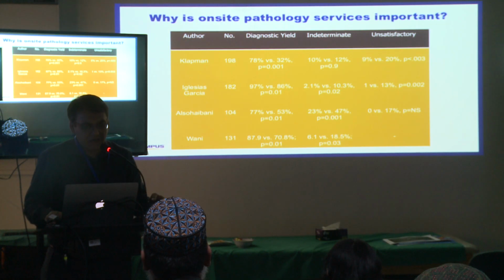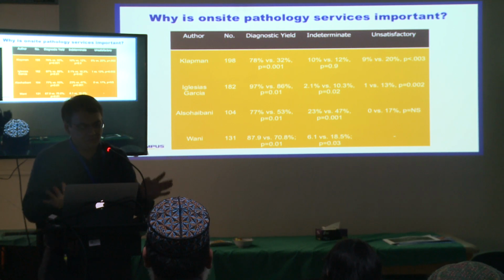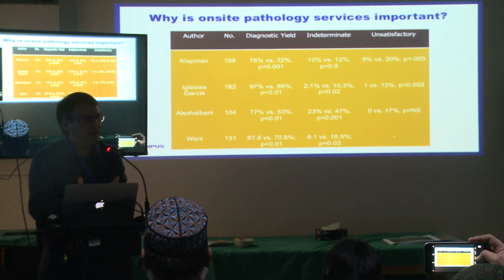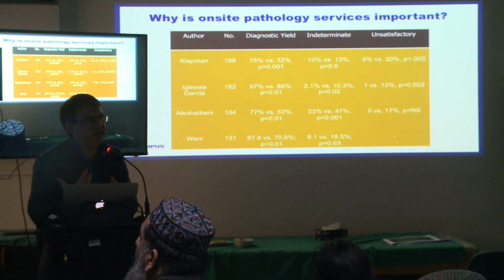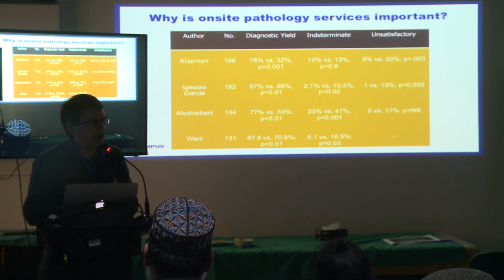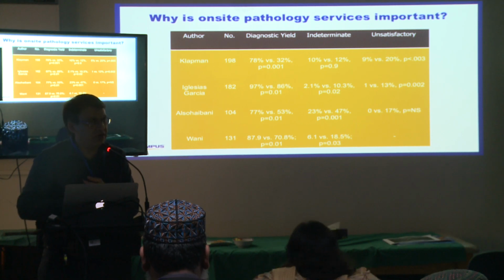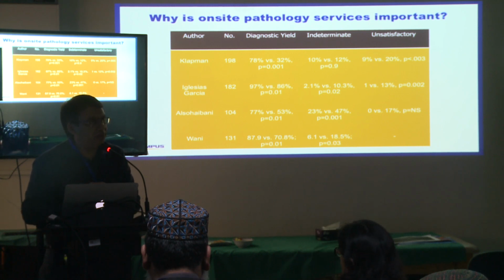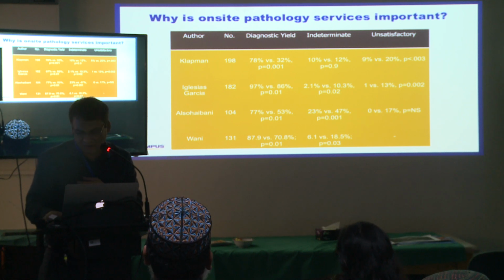Okay. These are the initial studies. Bottom line is these are mostly studies which were performed with the FNA needle. And for those, they have proven that on-site cytopathologist presence helps you get a better quality specimen, helps you decrease the number of indeterminate specimens, and gives you some on-site diagnosis.